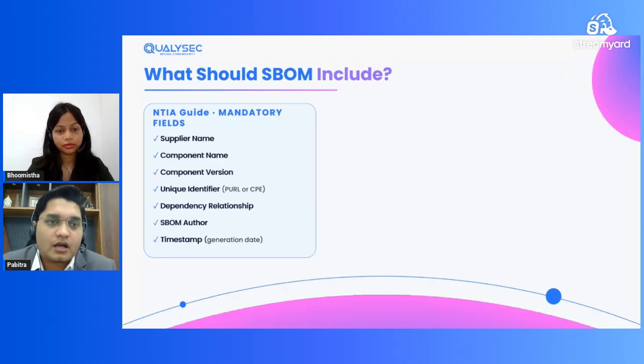They put a very random common name like encryption technology. No, here we have to put the component name. For encryption, what are you using? If you are using OpenSSL, then you mention the component name is OpenSSL. Then component version. Without the version name or version ID, we cannot proceed to calculating CVEs. Is it 1.1, 1.3, 3.0, or something else? If you are using Apache, what is its version number? You have to mention the version number also.